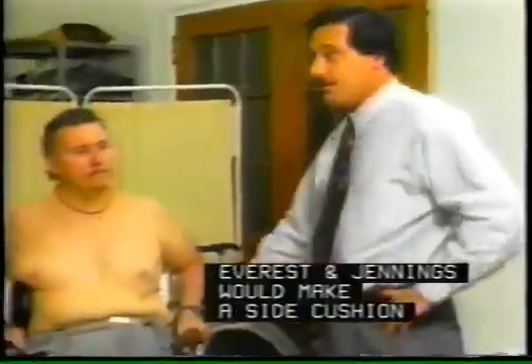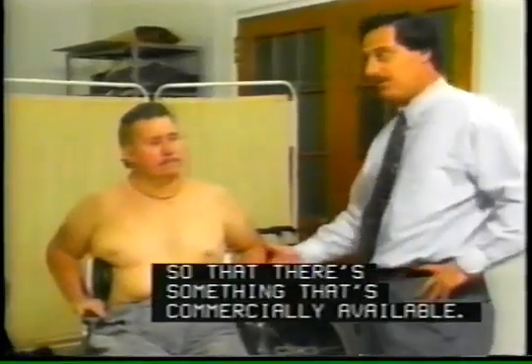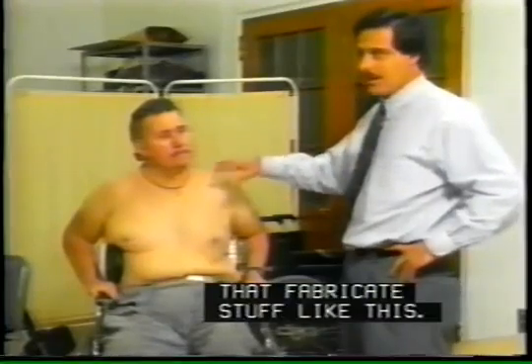I know there are several cushions we can use to distribute the pressure evenly. Should we customize the back support? Do you know of a commercial option that could give me those kind of two points of contact that would create it here? Everest & Jennings would make a side cushion so that there's something commercially available, and you could have something like this fabricated from some commercial companies that mount a little bit differently, instead of onto a solid back that would swing away. There aren't that many commercial companies that fabricate stuff like this. You can get something we consider commercially available through a customized shop, and that's pretty easy.